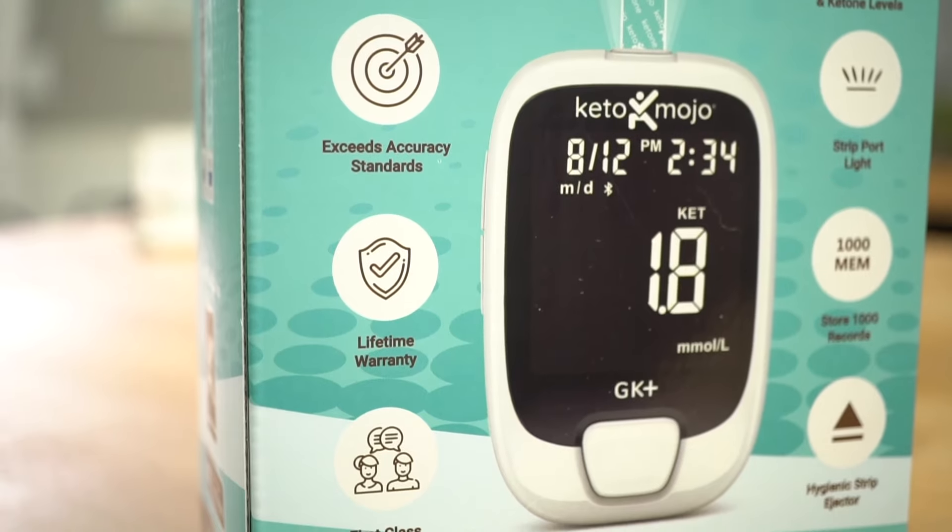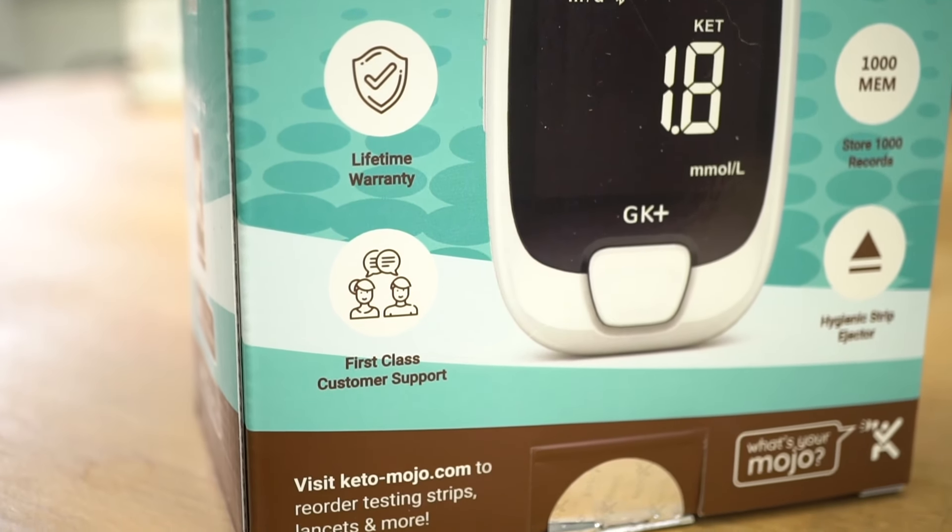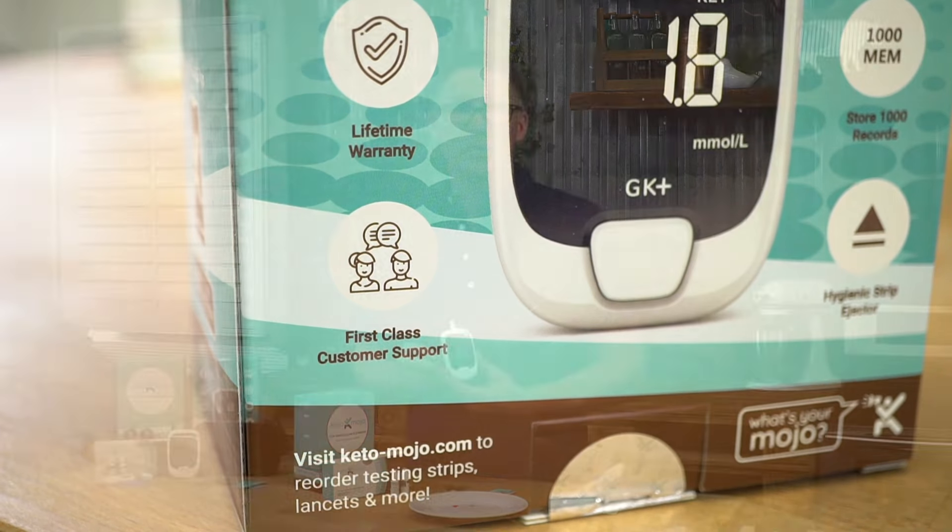We know that our meter is working to the FDA standard. But if there is ever an issue and it's outside of that range, contact our customer support — we'd be more than willing to help you, because we have a lifetime warranty. Don't forget to register on our website for that.